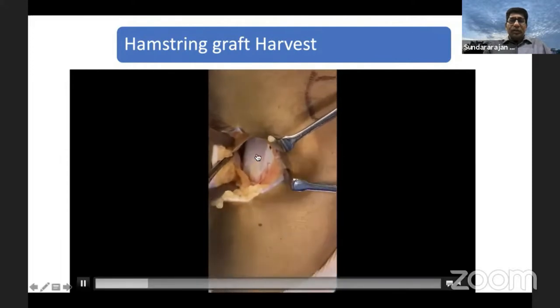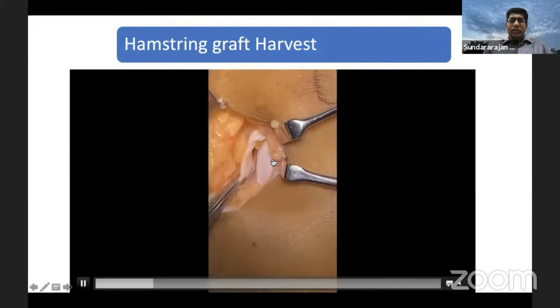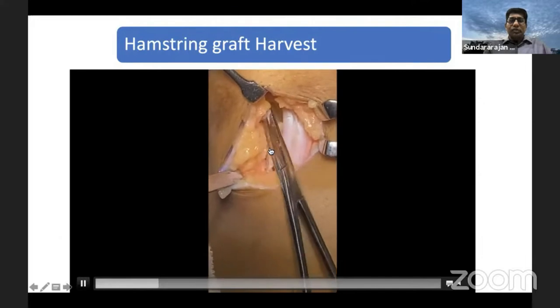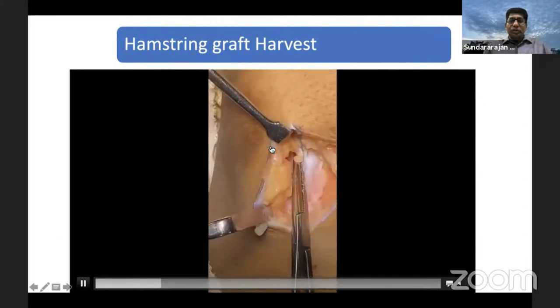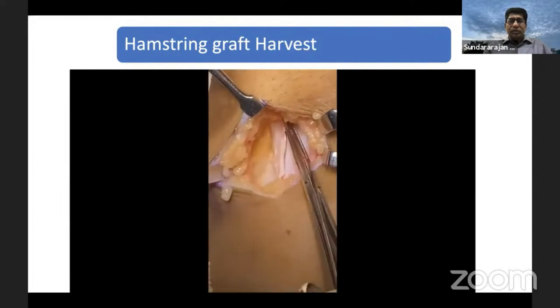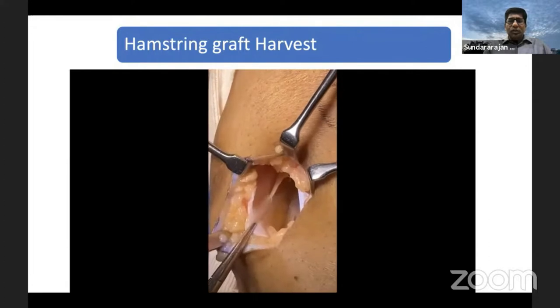What you are seeing underneath — the glistening structure — is the superficial medial collateral ligament. You can see that is the superficial MCL, and this is the Pes Anserina. The Pes Anserina has got sartorius starting proximally, then gracilis, then semitendinosus. That is the Pes Anserina. Once you hold the Pes Anserina, then you can see here what you are seeing is the semitendinosus.